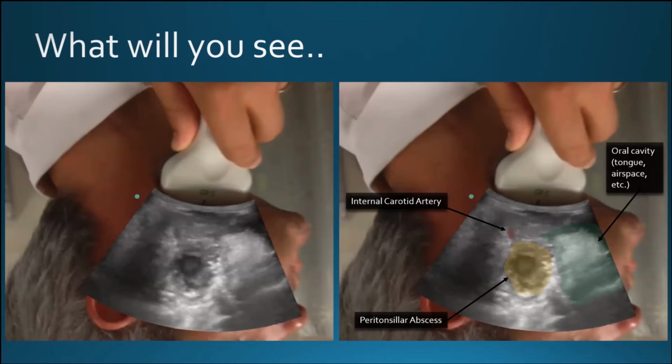And one thing when you do these abscesses, and this is true of any abscess in general, you always want to throw color flow. You want to throw color flow, one, in this case, because of how close these vascular structures are, so you can identify them. But also because you don't want to accidentally diagnose a potential pseudoaneurysm as an abscess and put a needle in there, because that would not be a good idea.